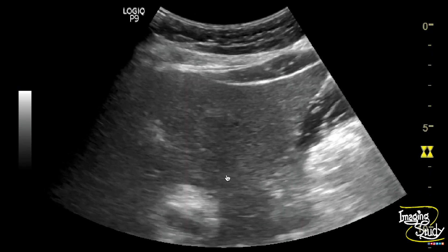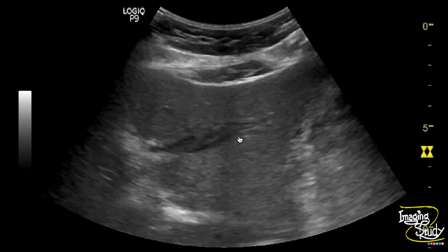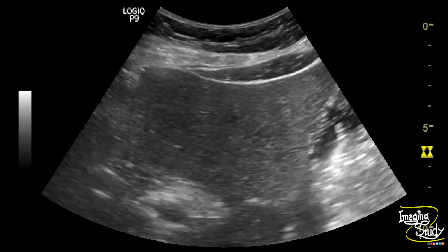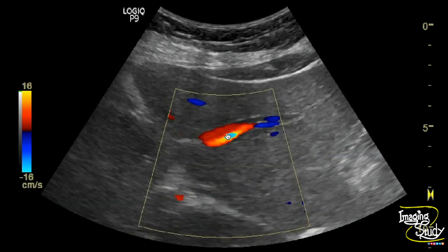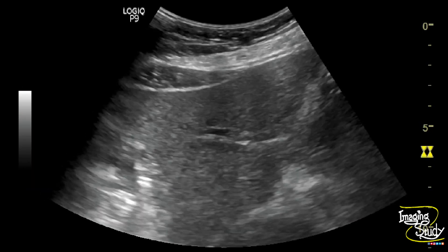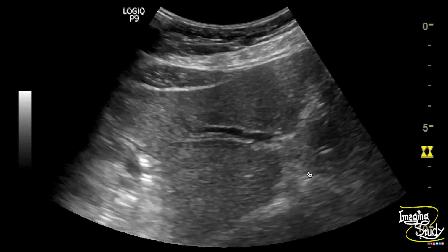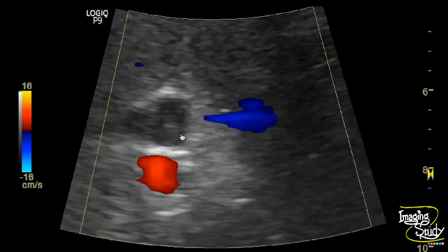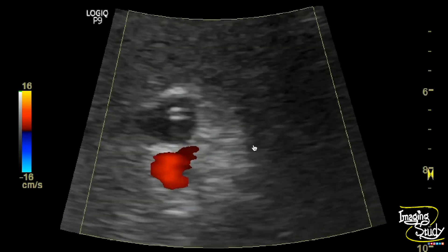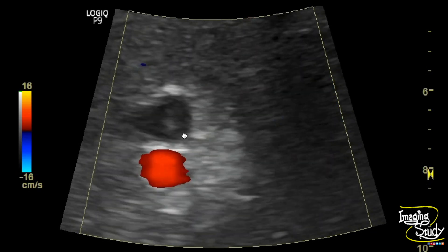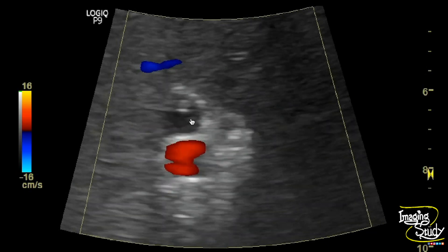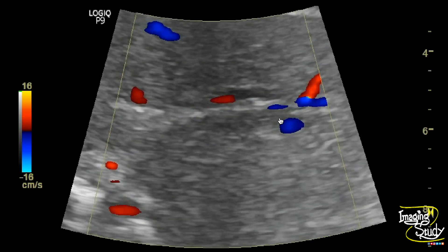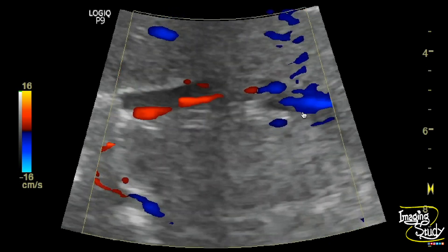This is the left hepatic duct. It looks dilated also, and if you check carefully you can see a linear hyperechogenic structure within this hepatic duct. This is the cross-section of the dilated duct and you can see the hyperechogenic structure is moving. Again the longitudinal section — this is the hyperechogenic structure within the dilated left hepatic duct.